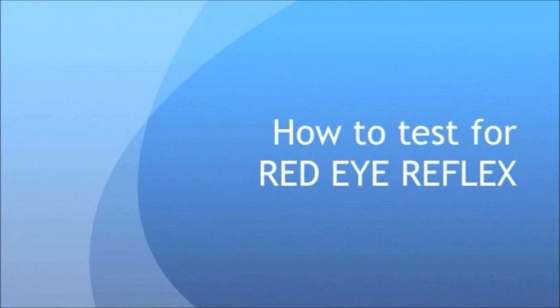So how to test for the red eye reflex? This test has to be conducted in the darkened room. Then have the patient look at a distant object behind your shoulder. This facilitates testing by causing the patient's pupils to dilate.